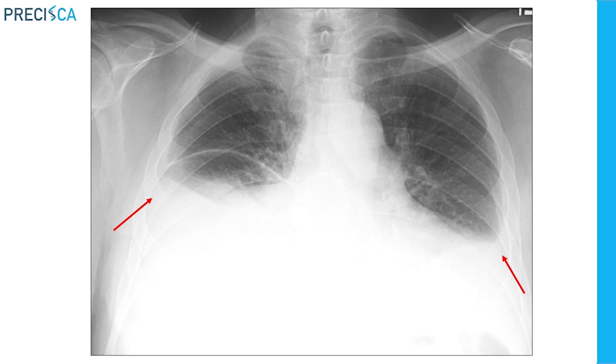Now, this is another patient who had smaller amounts of fluid. This patient is also standing up. And what we see is the black part on both sides is the lung. In the middle, we have the heart. And then this white part here is the fluid. And there's a smaller amount of fluid than in the previous case, but a little bit of fluid. And it even goes into a little bit of a space in between the lungs. So this is someone who had heart failure and had these small effusions.